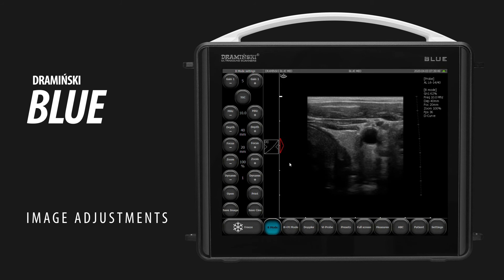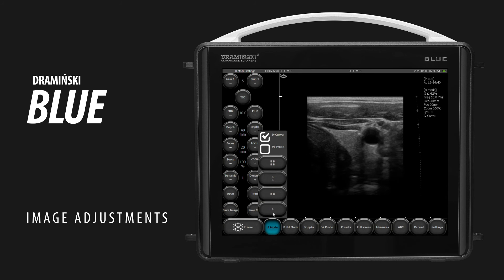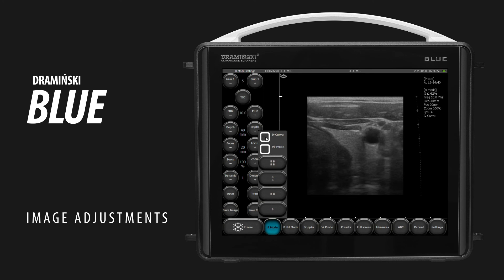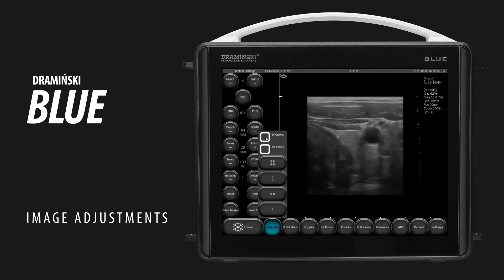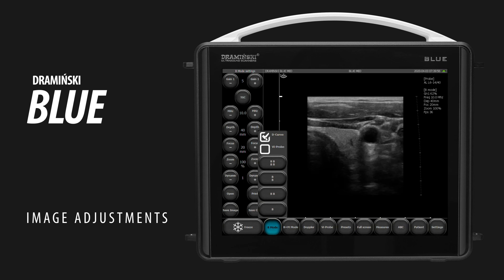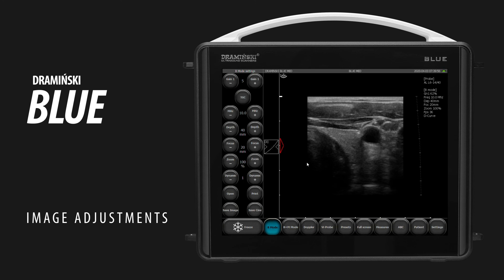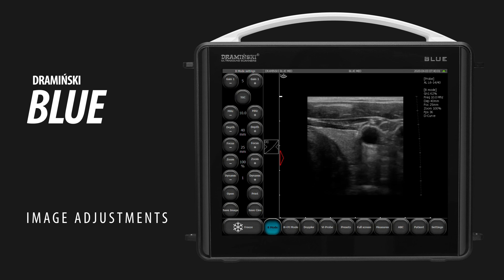To enable or disable D-curve, tap B-mode and check the D-curve box.